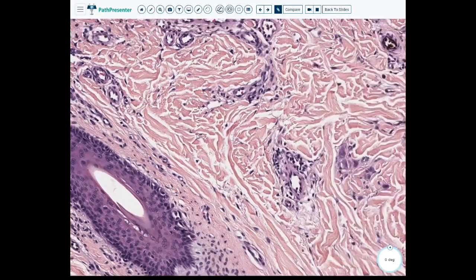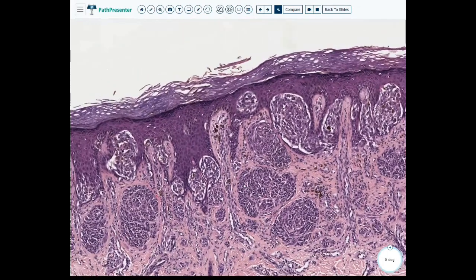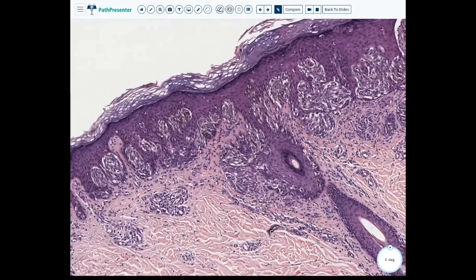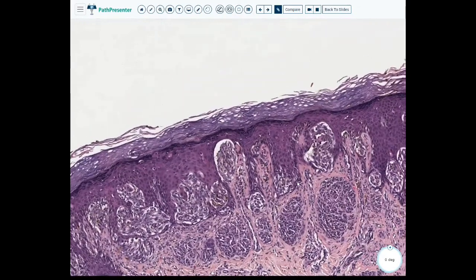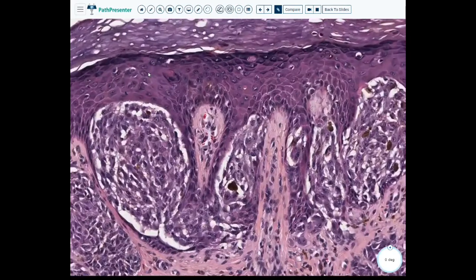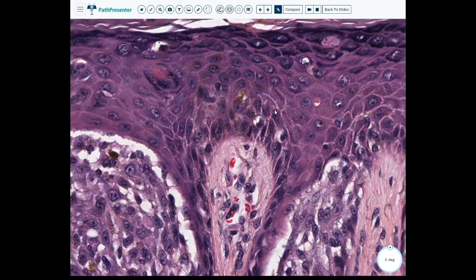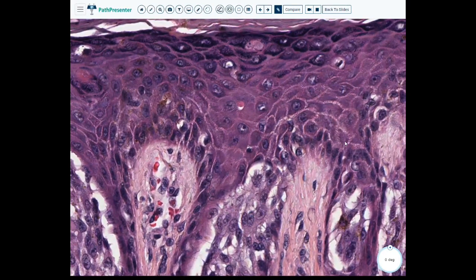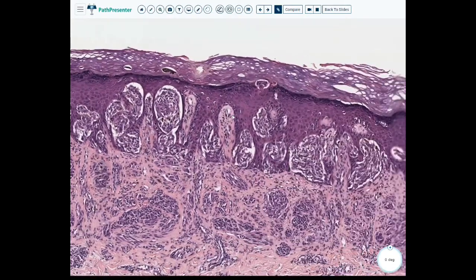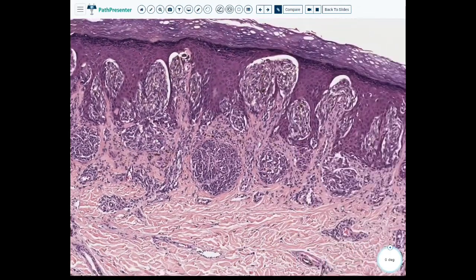Don't think I'm seeing anything. It looks like giant cells, which you can see. Doesn't look like we have pseudoepitheliomatous hyperplasia, which you can also sometimes see with this. Is that another Kamino body? That looks dyskeratotic. Maybe that's a Kamino body. It looks better for one. But we have Kamino bodies. We have all this other stuff going on. So this is a Spitz nevus.